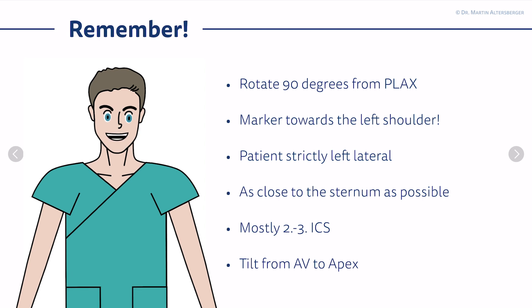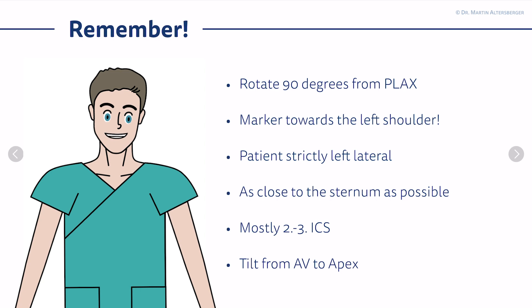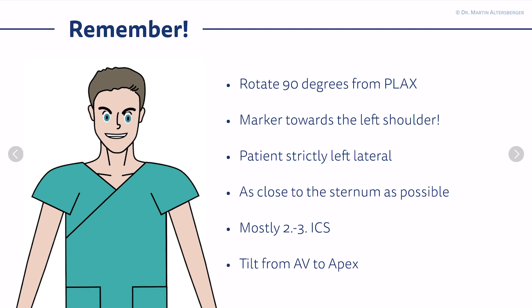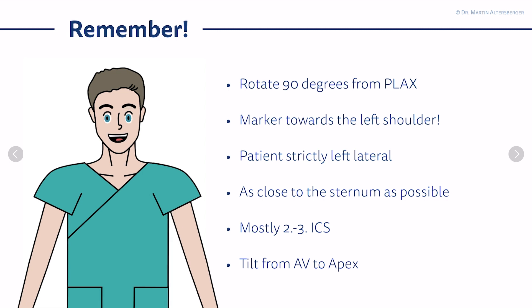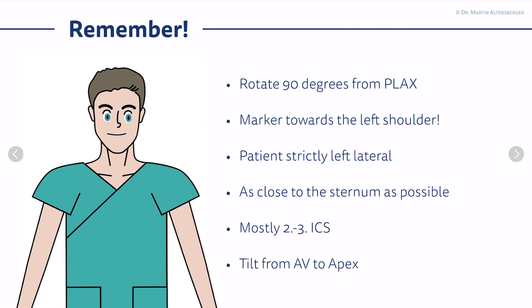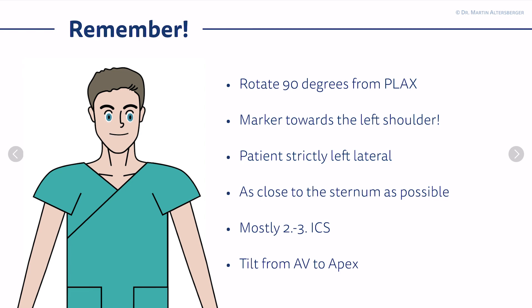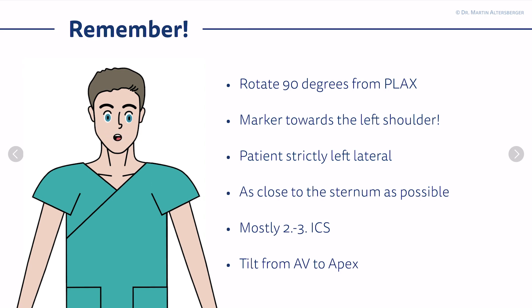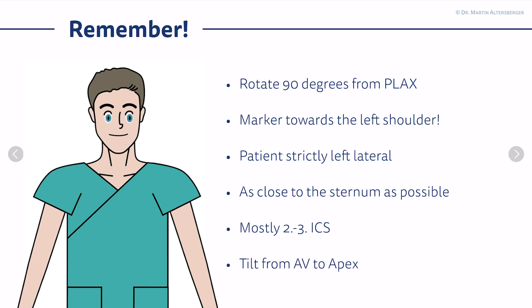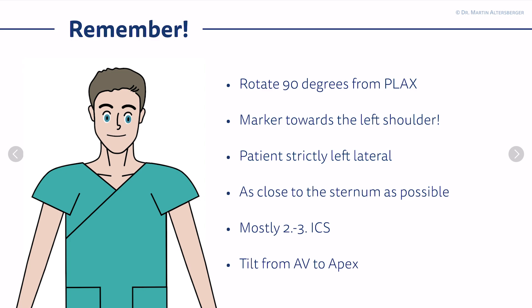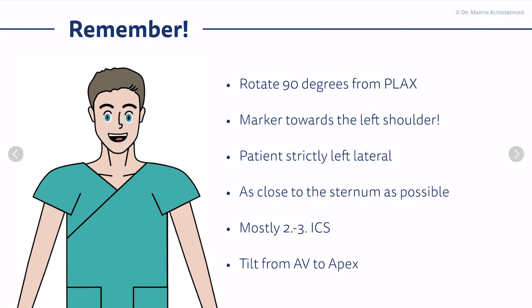The patient is still in a strictly left lateral position to make scanning easier, and you scan as close to the sternum as possible. Otherwise, it's very likely that the lungs will block our field of view. It's mostly located in the second to third intercostal space, and you can tilt the transducer from the aortic valve all the way to the apex, scanning the entire cavity of the left ventricle.